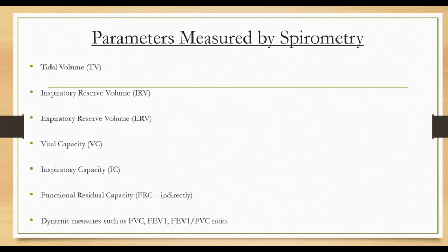Let's see the parameters measured by spirometry. Tidal volume, inspiratory reserve volume, expiratory reserve volume, vital capacity, inspiratory capacity, functional residual capacity, dynamic measures.